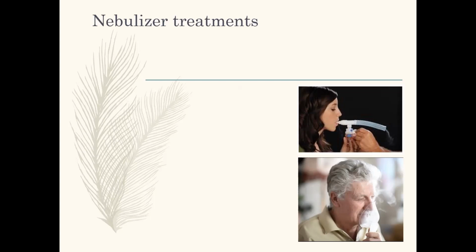The client may need to rinse or gargle and spit with water afterwards, depending on the type of medication. We want to clean the mask, mouthpiece, or cup as directed and allow it to completely dry. So these are the ones we typically kind of clean out and we leave them sitting out to dry, especially if they're at home and they're utilizing this over and over again.